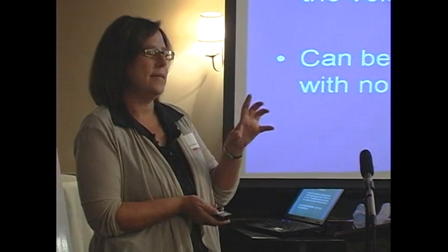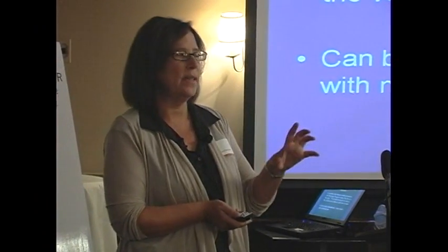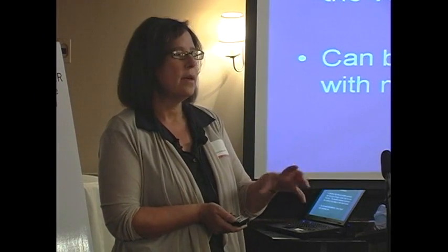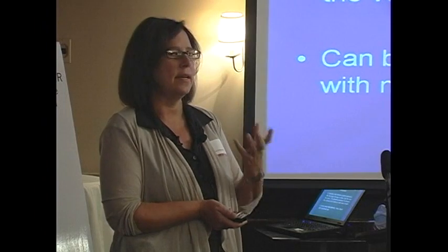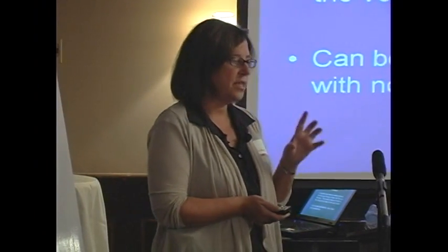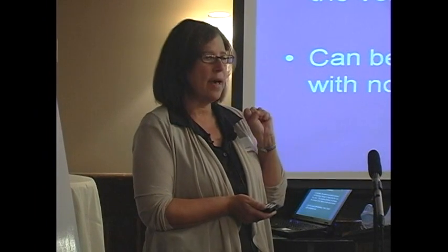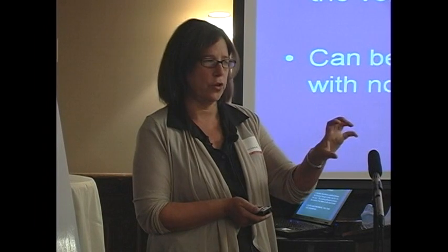But the whole idea is that, again, we talked about hypoventilation, that if the diaphragm is weak, the amount of air being inhaled into the lung is not enough. So what BiPAP does is the machine delivers a certain amount of air, not a volume of air, but a certain amount of pressure.